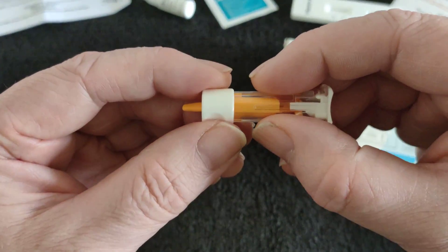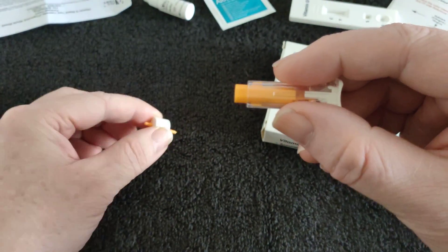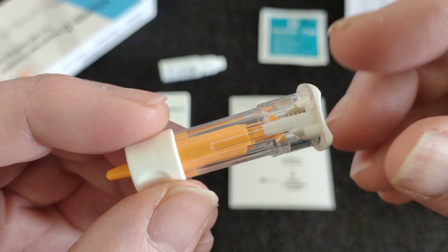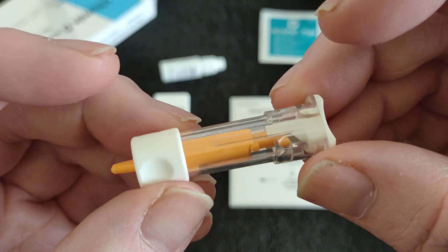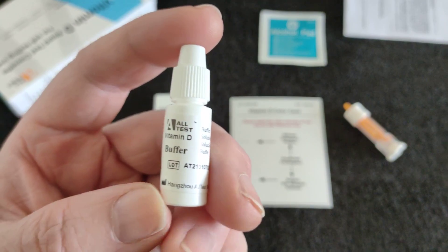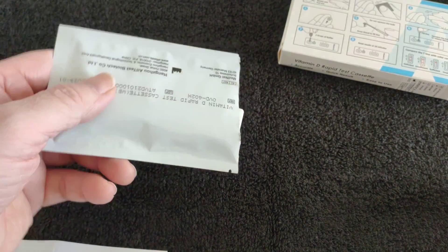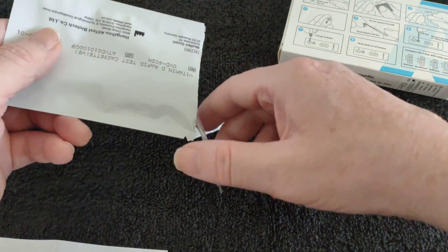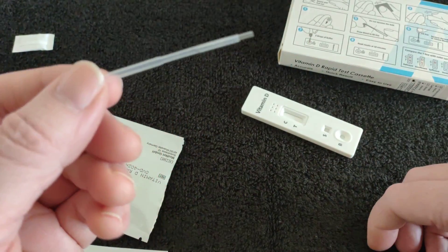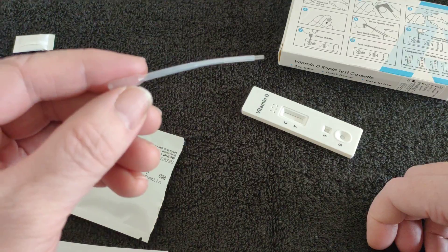This is the lancer — I've already done this one. You rotate it and pull it out; it says a lance that's in there. This contains two things — well, three things, but that doesn't matter. That's a silicon thing — don't lose it. That's the blood collector, the capillary blood collector.